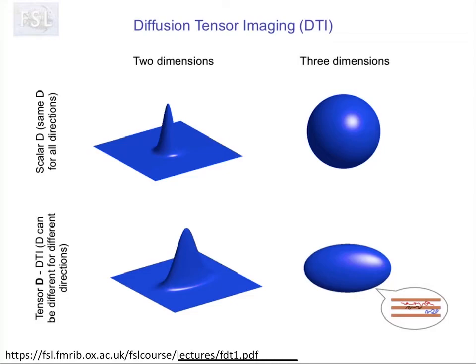Okay. So moving along, diffusion tensor imaging is trying to map out the shape of the diffusion. It's trying to map out the shape of the ellipsoid. In 3D, it looks like that. And for this one, we would say the primary direction of diffusion is along the long axis of the ellipsoid, the longitudinal axis of the ellipsoid.